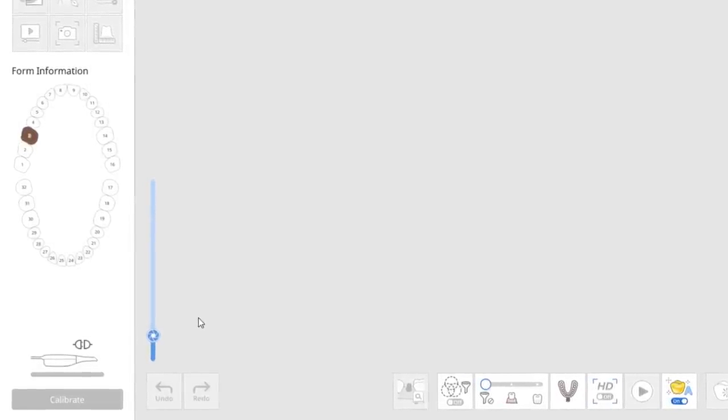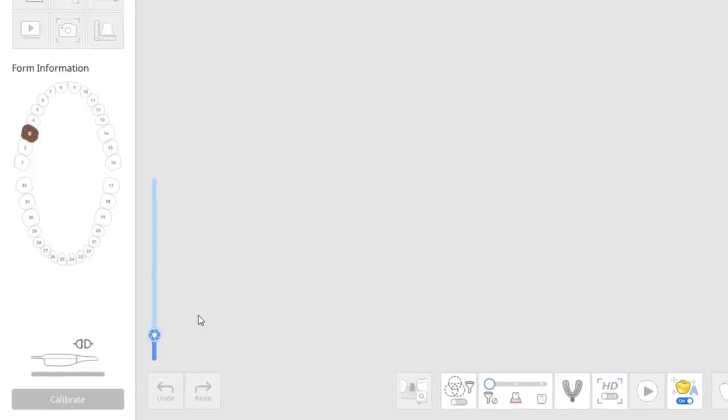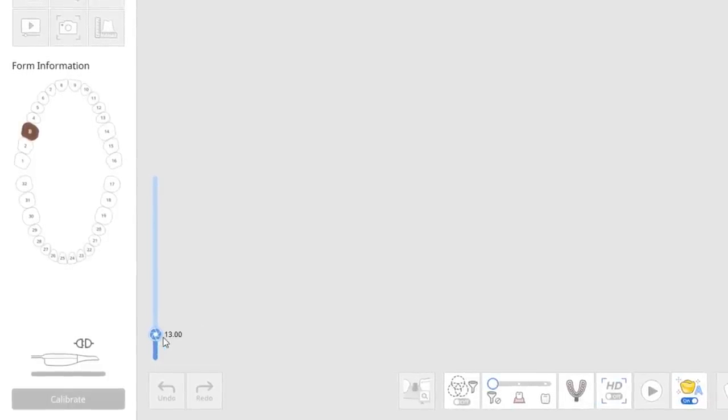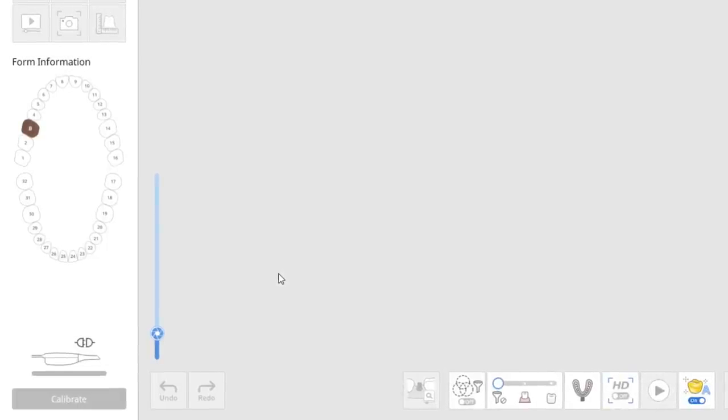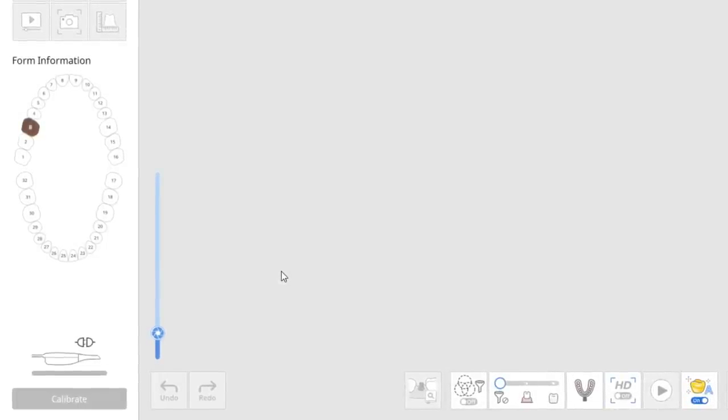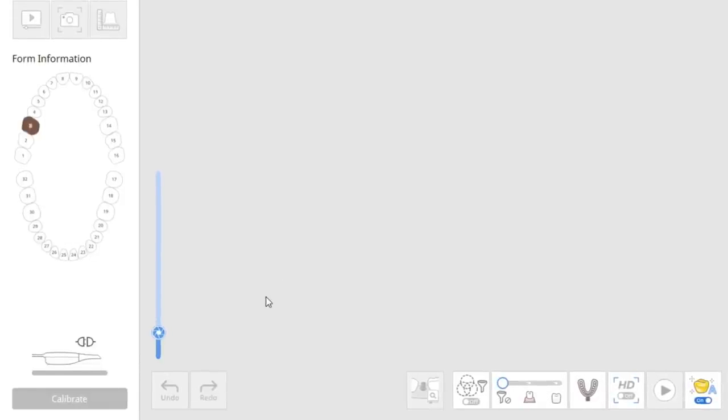This comes in very handy when you're trying to capture an open bite for an oral appliance, and you don't want the camera to see the tongue or the oropharynx that's moving. You don't want it to see saliva. So it's good at hiding things, and it's great for new users who could get the camera distracted with the lip, the tongue, and all these other things that move.